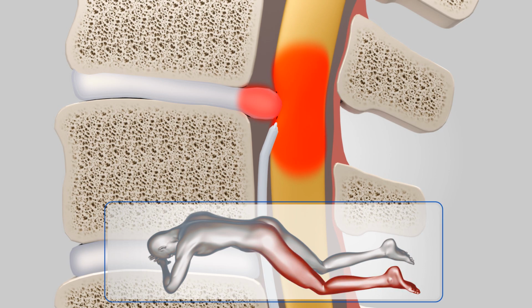If the patient complains of severe pain after slightly pushing the laser fiber to the supposed target point before stimulation, there is the possibility the laser fiber has touched a nerve. In other words, to use lasers safer, the surgeon should find out where the pain point is by stimulating with the laser fiber or endoscope cable.